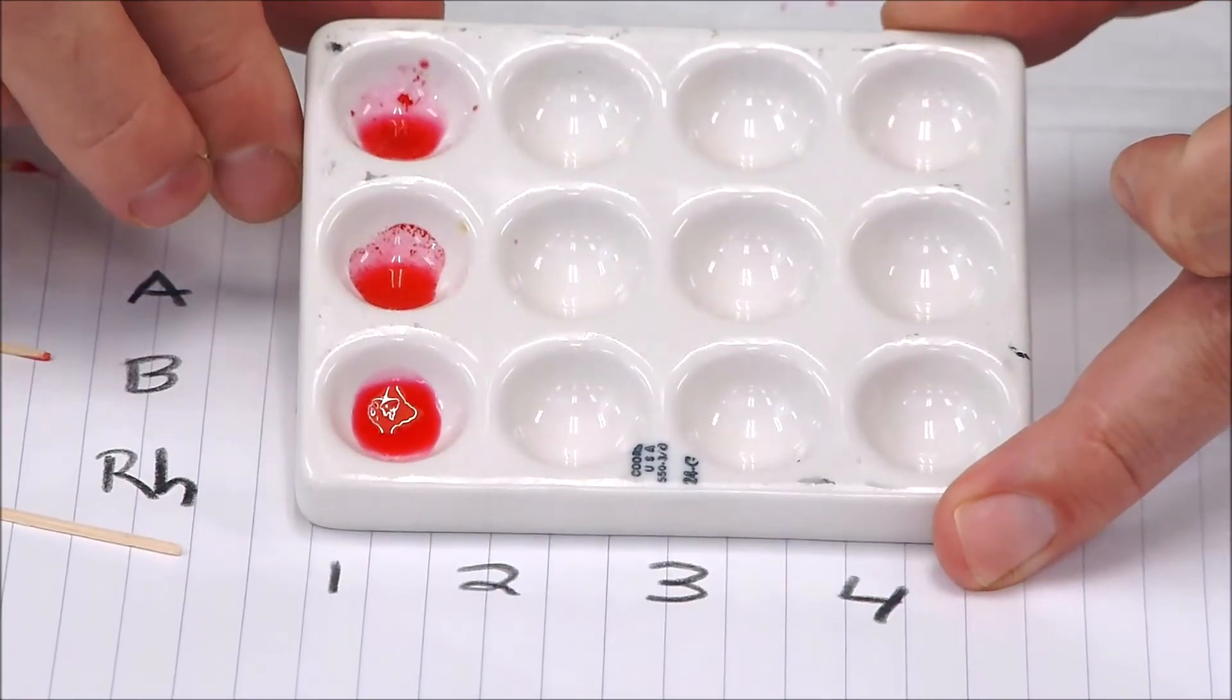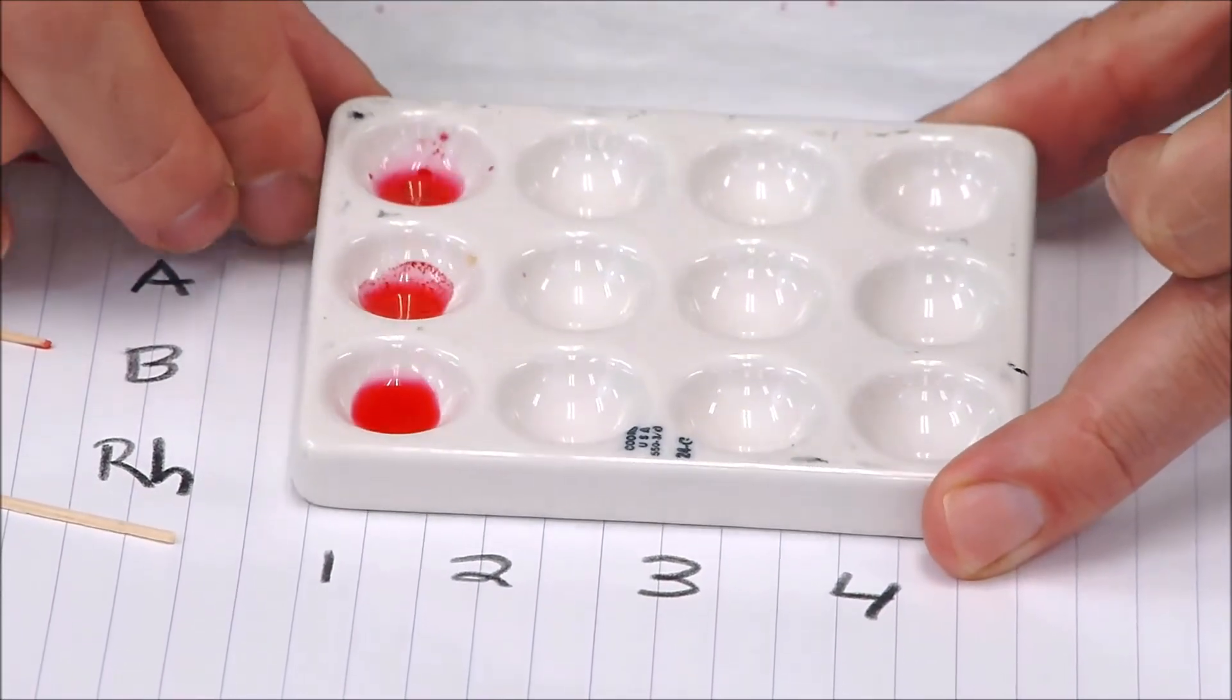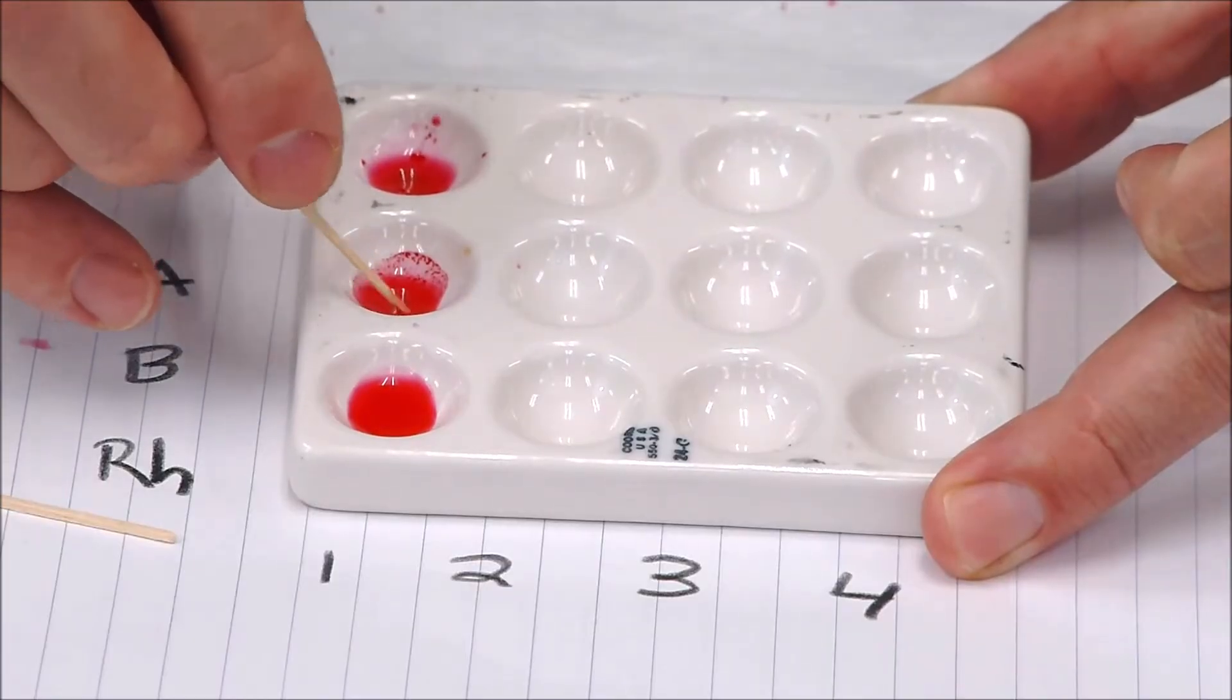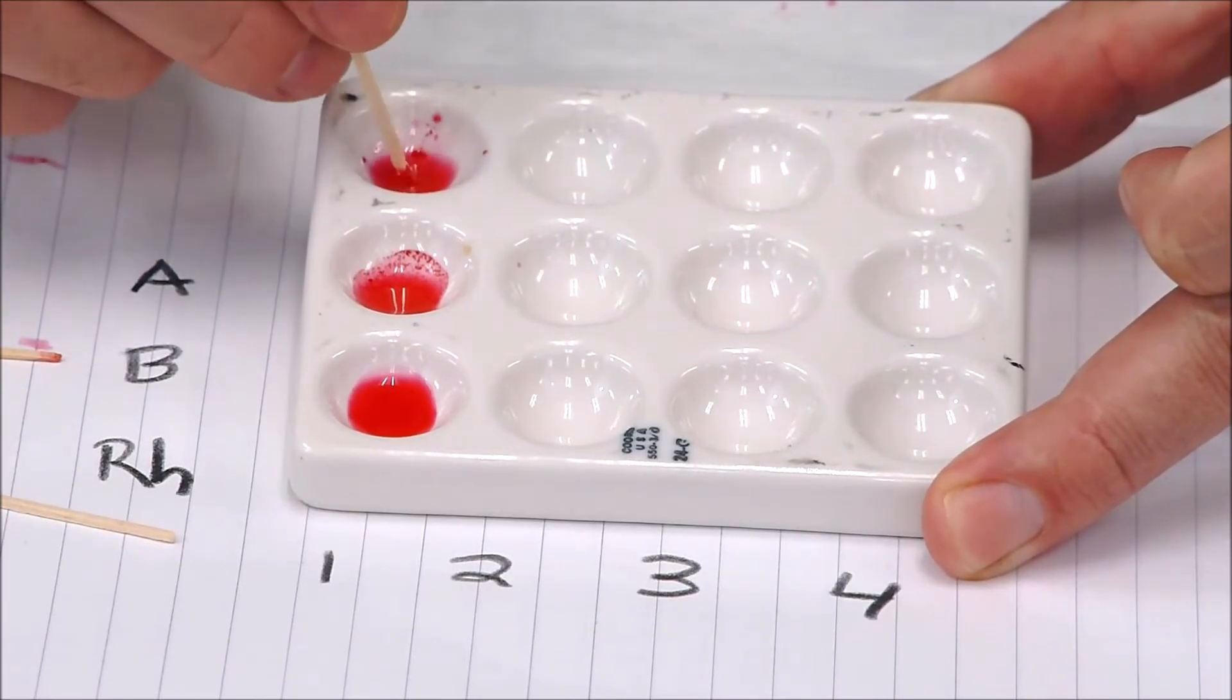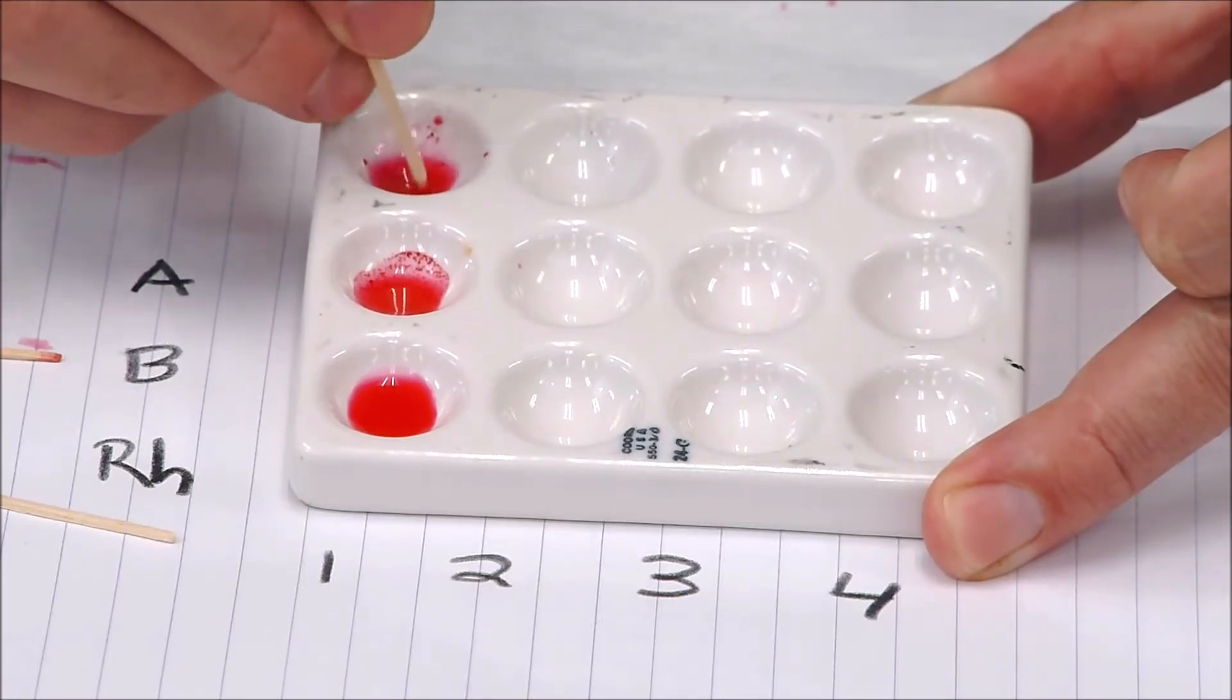Okay, now let's take a look at our samples. What we can see here is it looks like I definitely have clumping or agglutination down here in the B well. So in that case, we know that I have the B antigen in that blood, because if the antigen and the antibody meet, then it causes agglutination.